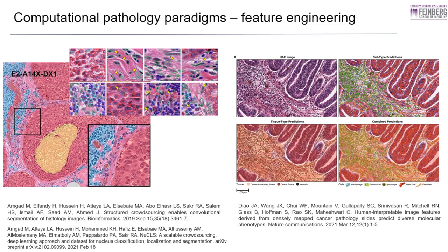And so there's a company called PathAI that is also, I think, well known. And they have more of an approach like this, where they pay an army of pathologists to generate the annotations, and then they train the computers to do it automatically. And then they have an array of measurements they can make from the specimen, and they can use those to build prognostic models, or to provide tools for someone who's reading a case.